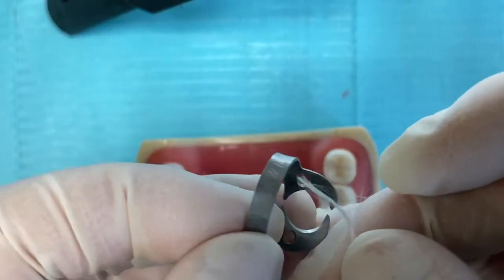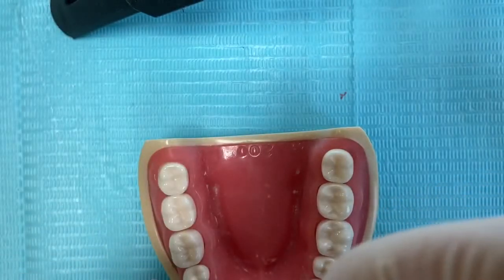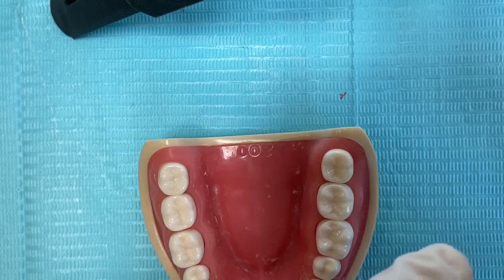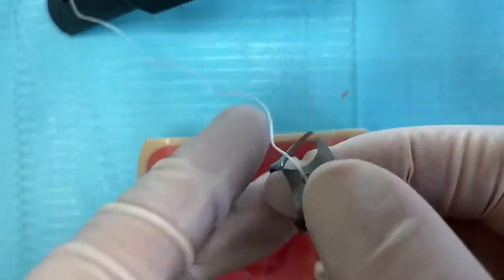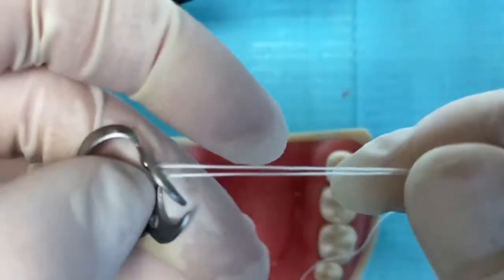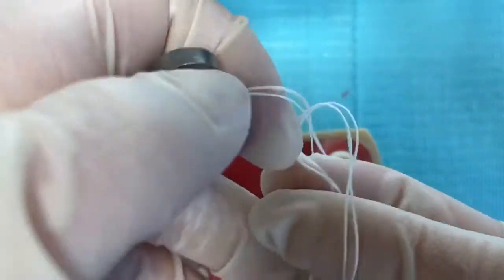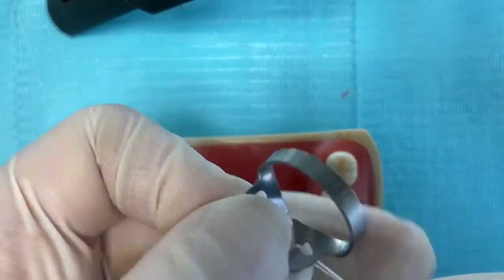So what do we do? We insert one part of the floss inside the hole. I'll go ahead and insert it, and then we have to tie it all around the clamp. Here I've inserted one part inside the hole. I'll go ahead and tie it, and then I'm going to rotate it all around the bow. I'll make a tie, and then rotate the dental floss all around the bow to secure it.